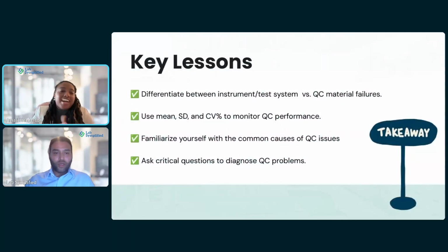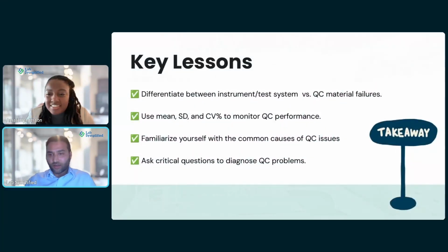So I have one more question here. I think it's related to the previous question. It's about what can cause the narrow range. Elisa said sometimes techs don't record the out of range values, and that causes tight ranges. How do you encourage techs to include these values, or should you?